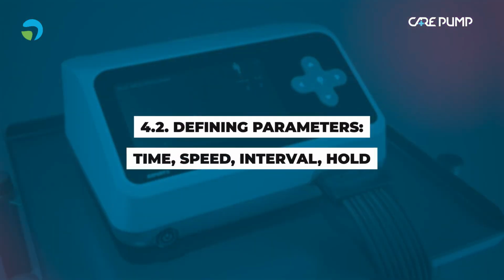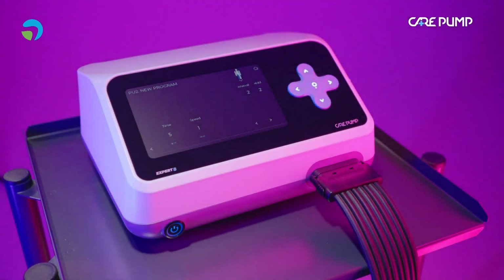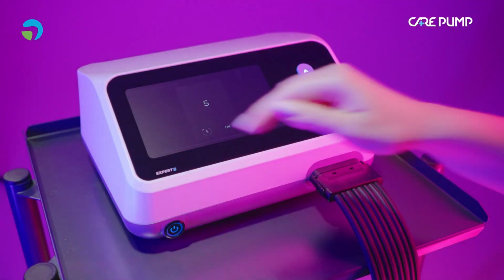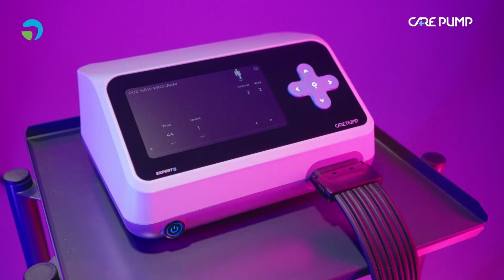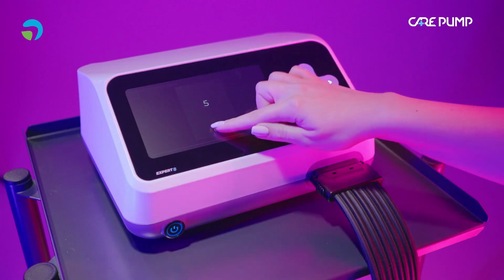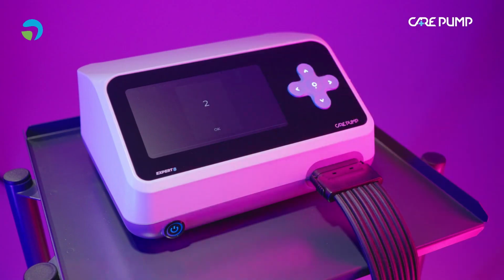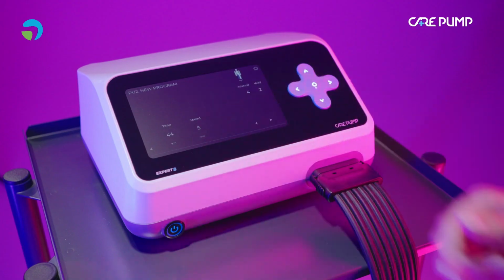Defining parameters: time, speed, interval, hold. Set parameters for the new program: time, speed, interval, hold by selecting the appropriate values from the list.